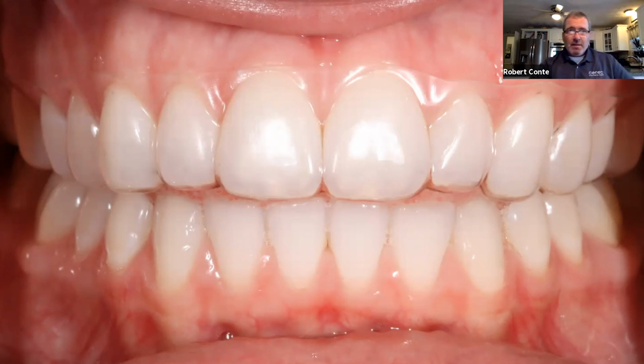So if you look at the time involved, whether you took them out of hygiene or you had them in for a separate visit, we're looking at barely 30 minutes of chair time. The prescription process, you can do at home on a computer if you want. And then the seating of the aligners, including adding any attachments, that's another 30 minutes. So this is a pretty high profit procedure with very little effort, and it's super predictable if you're selective in your cases.